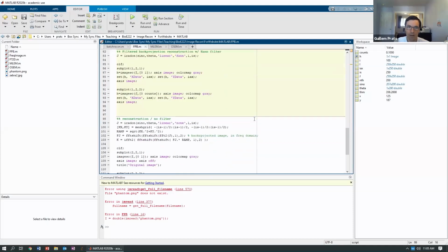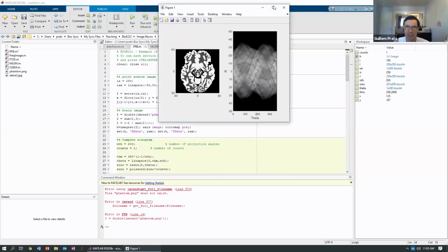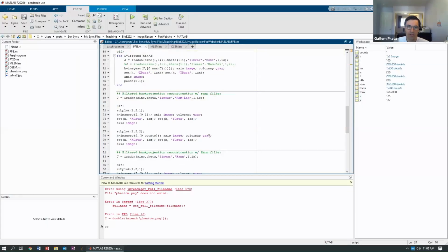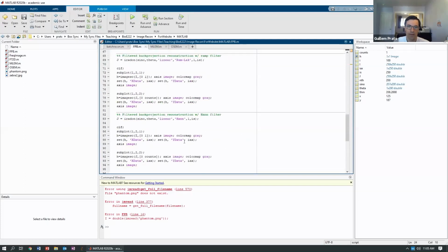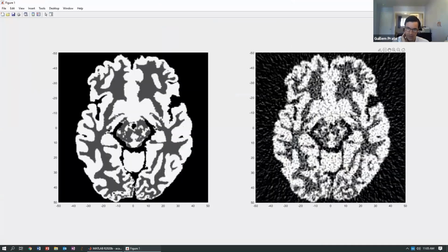All right. Maybe I could try again with slightly less noise here. I'm just going to put 10 times less noise. This is the sinogram corresponding to that. And now if I go to the reconstruction here, sorry. Yeah, so if we do the reconstruction here, this is with 10 times less noise, and now that's a fairly good image that's coming out of the reconstruction.